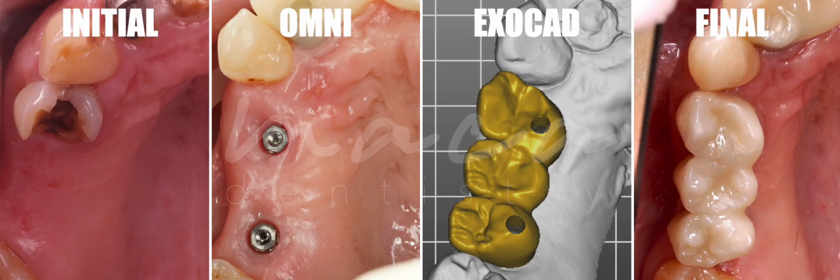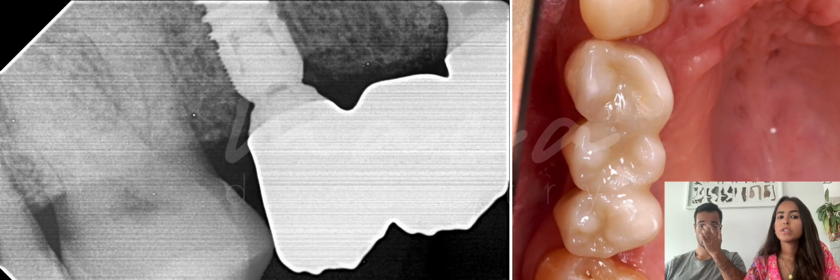And here we can see an occlusal view of the workflow for the posterior bridge of the first quadrant: initial situation, then the OMNIs, the exocad process, and the final situation. This is a close-up picture of the bridge and also the periapical x-ray confirming the proper adaptation of the bridge to the OMNI abutments.